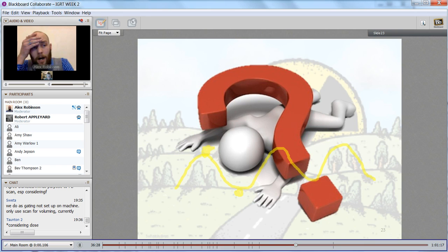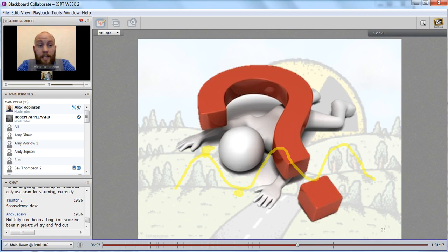I've seen some departments that when they recon their 4D patients, it really takes a considerable amount of time. Now on the Siemens scanner, we were quite fortunate that it would recon in the background and we could still scan over the top. But I know that there are a few departments that will wait till the end of the day once they've finished scanning to then recon. So we have to really consider these things. What do you think, Rob?